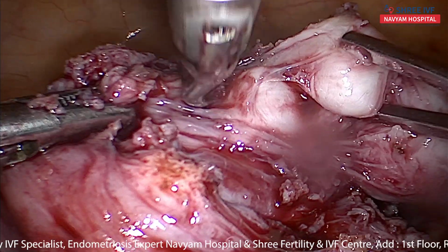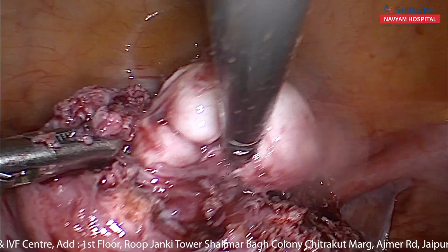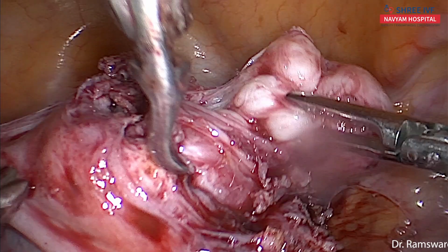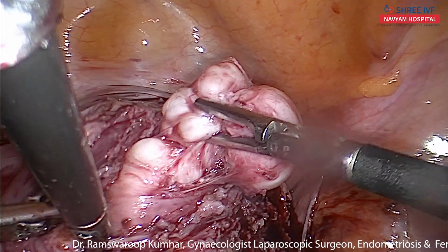This is another myoma, I think. Hold that. This is a larger myoma. Wow, great.